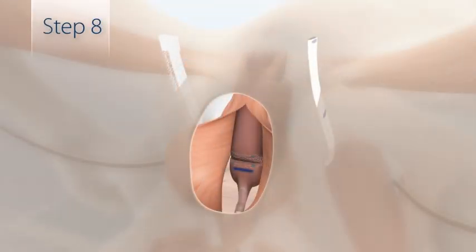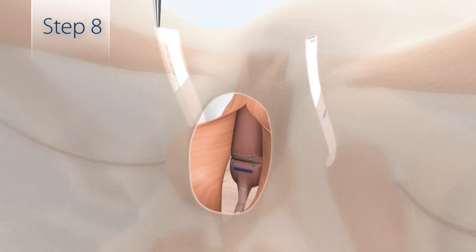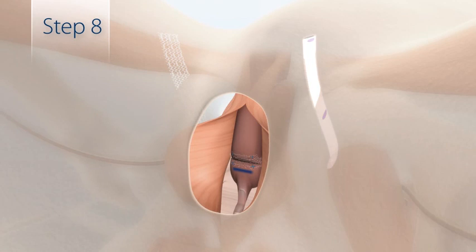Once correct positioning is achieved, remove the sheaths from the sling as demonstrated here. Pull the sheaths perpendicular to the patient's abdomen, avoiding creating acute angles of the sling arm during removal.